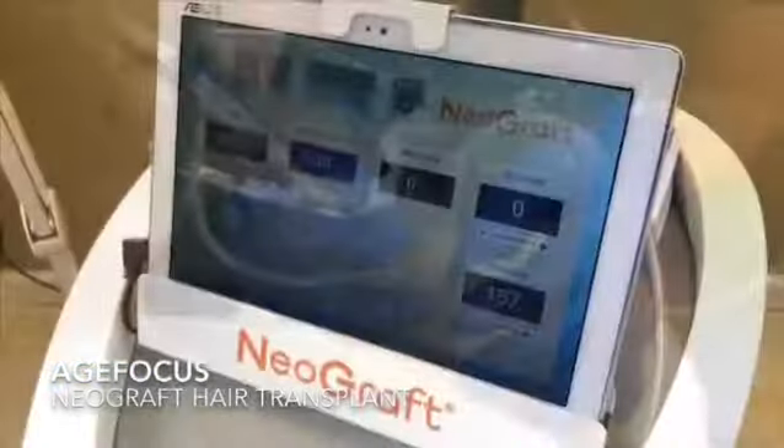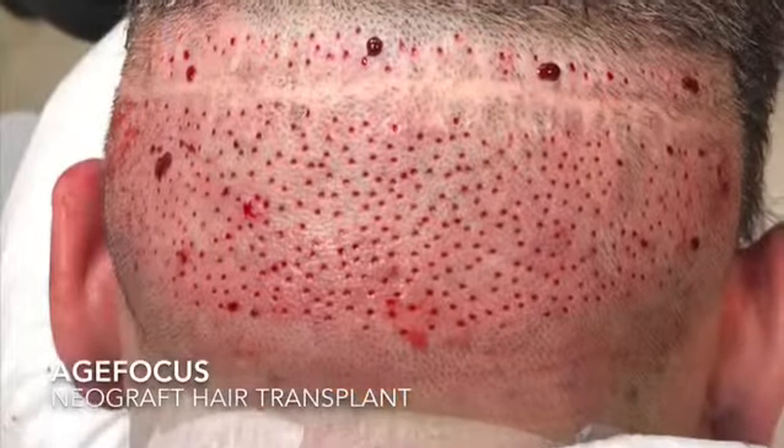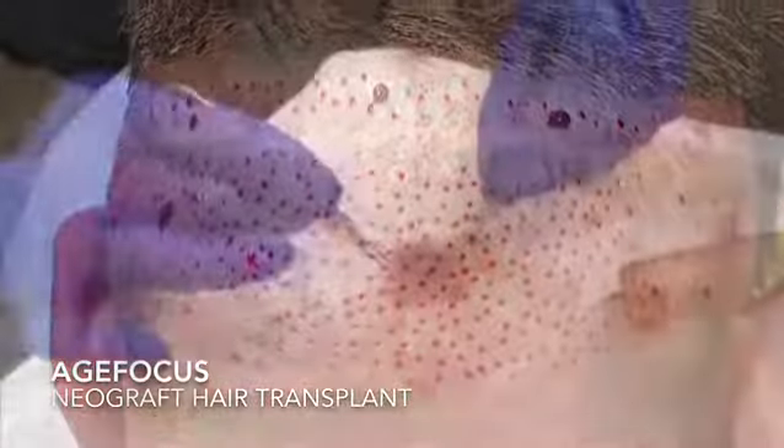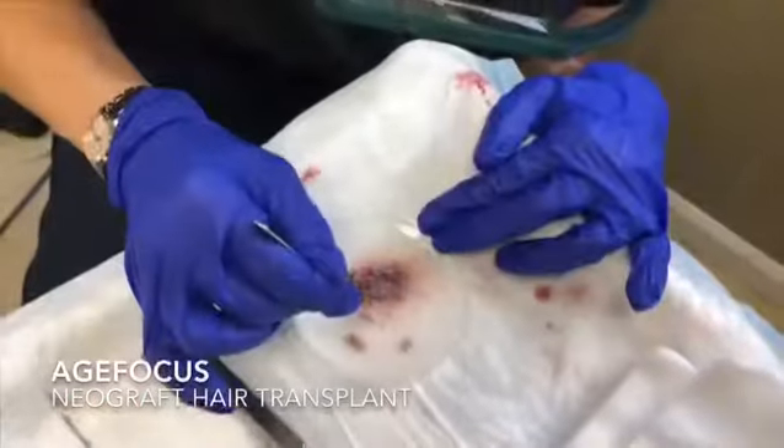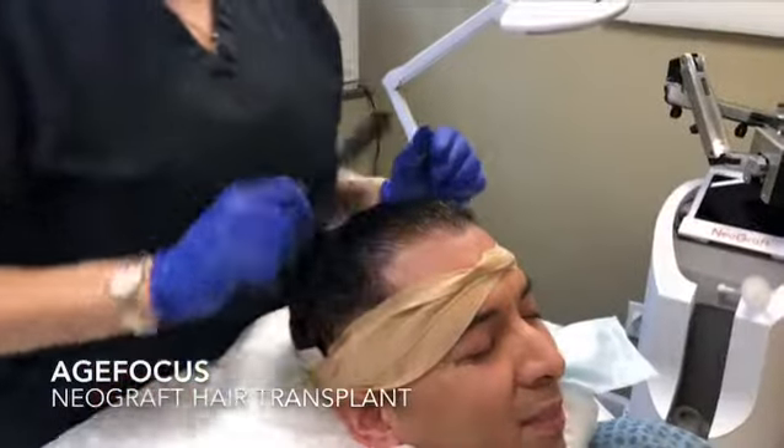The NeoGraft device then uniformly cores and counts the desired number of individual follicles and gently sucks them into a holding compartment. The follicles are then separated by how many hairs they contain for placement purposes to create the most natural looking results.